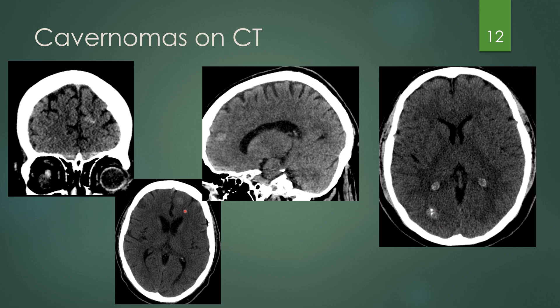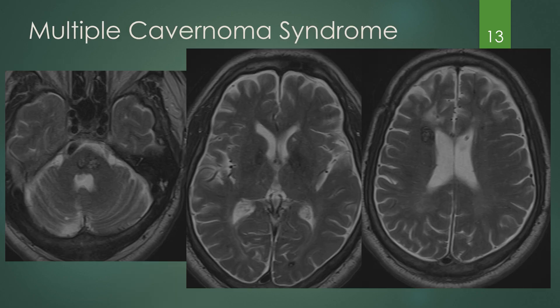Here's that same cavernoma in the left frontal lobe. You can get a multiple cavernoma syndrome, meaning multiple cavernomas in the same patient. This patient has one in the pons, one in the occipital lobe, and one in the frontal lobe — that is multiple cavernoma syndrome. So when you see one, look for two.